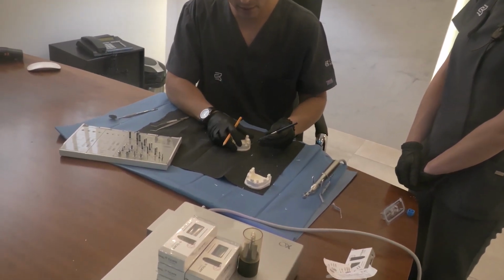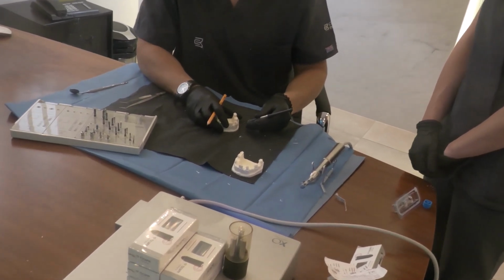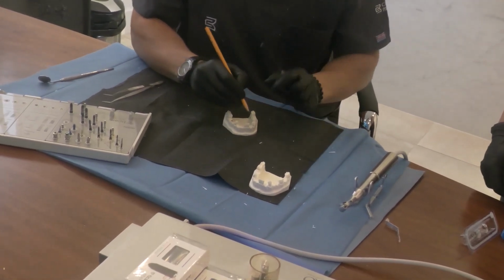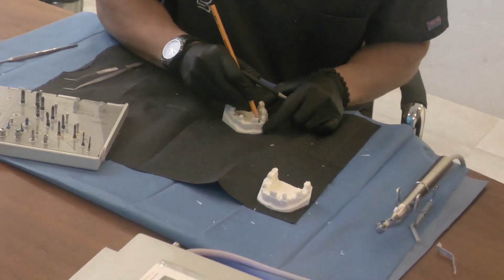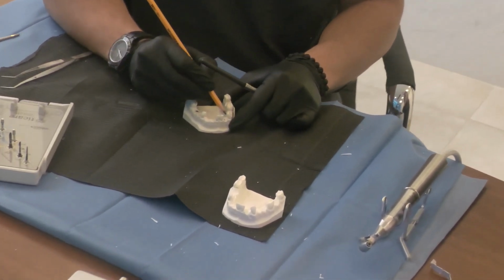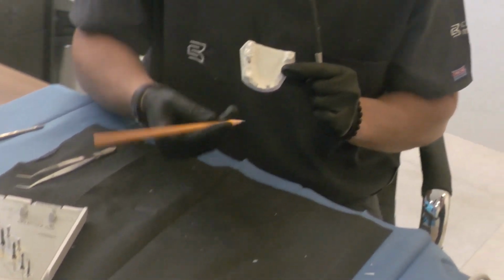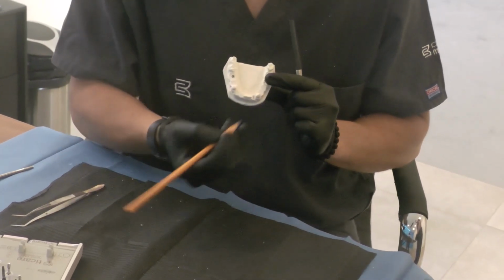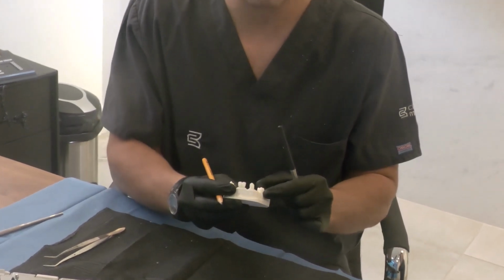We're going to be placing a 3.7 millimeter implant in order to replace a lateral incisor. So we have about 7 millimeters, right at the middle will be about 3.5 millimeters, and I'm sure that with this implant diameter we'll be able to somehow compensate the distance in between the canine and the central incisor. Again, you have to keep in mind the importance of the alveolar bone dimensions in a buccolingual perspective in order to warrant at least 1.5 millimeters in the buccal aspect.